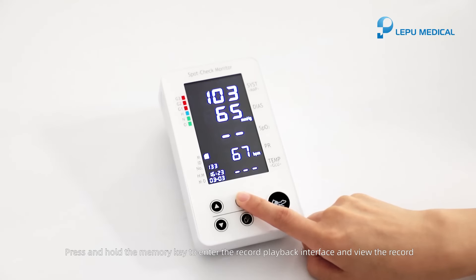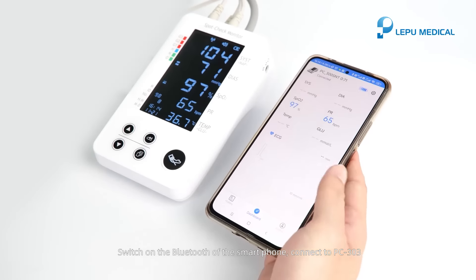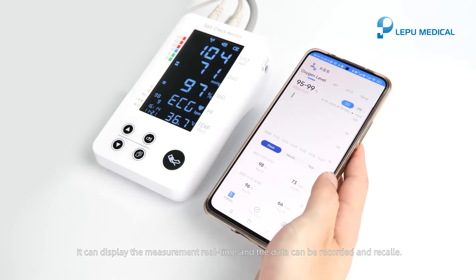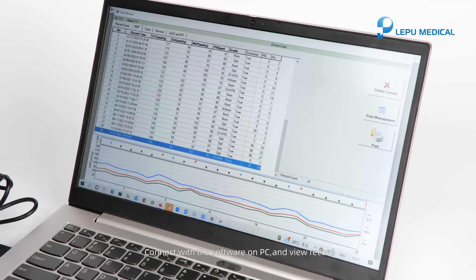Press and hold the memory key to enter the record playback interface and view the record. Switch on the Bluetooth of the smartphone and connect to PC-303. It can display the measurement in real-time and the data can be recorded and recalled. Connect with the software on PC and view records.